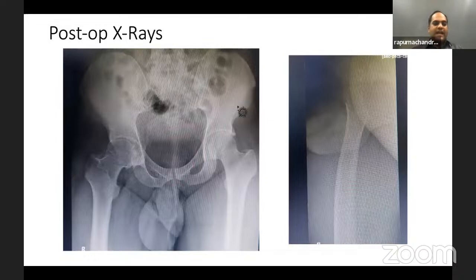Once you do that, you slowly go from lateral to medial. You cannot resect the posterior part, but the superior part, and the patient has gained around 5 to 10 degrees of internal rotation and 5 to 10 degrees of external rotation. I agree that he would go on for a hip replacement, maybe in 1 year, 2 years, but he is able to sit comfortably in a chair now. So as I said, if we do not do any harm, I think there is nothing wrong in going ahead and doing a hip arthroscopy in these kinds of patients and see if we can help them.